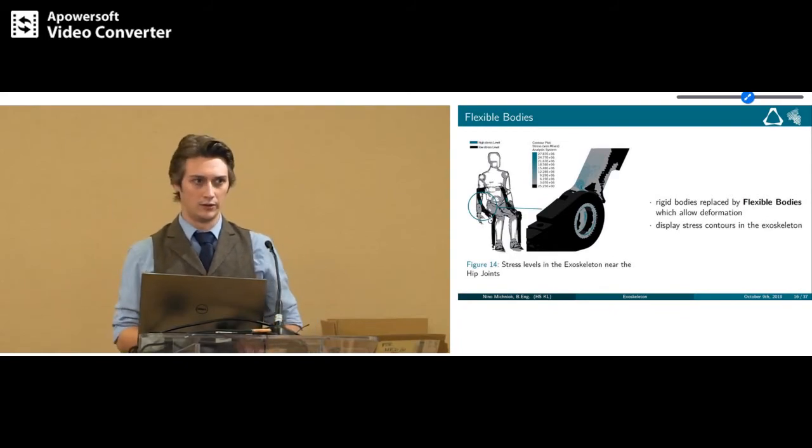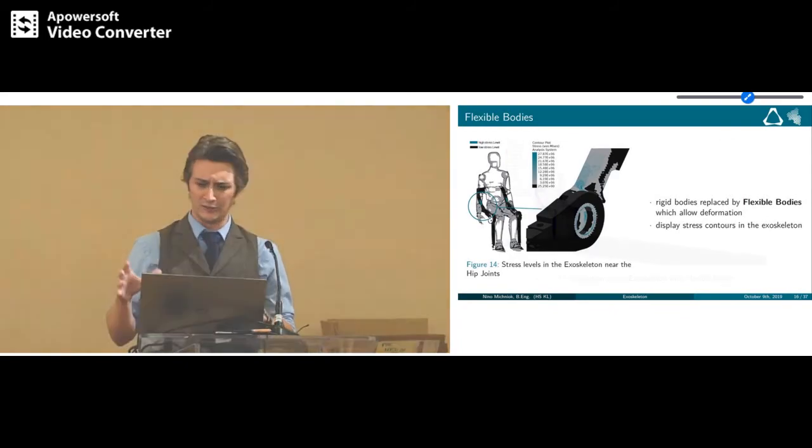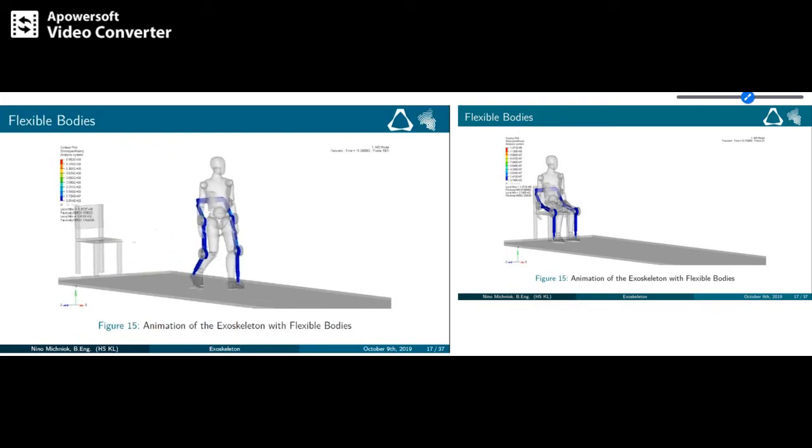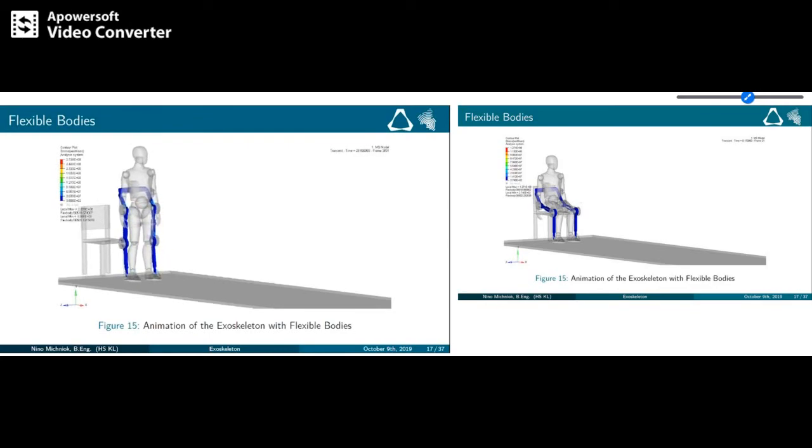And they allow deformation, and I could display the stress contours, which can be seen in this figure and in the next animation. I've added this because at that time this was my bachelor thesis, so I had some kind of progress of this entire work here. And quickly mentioned, my job was not to evaluate these stress levels, I just made it able to display them. So I can't say anything about that.